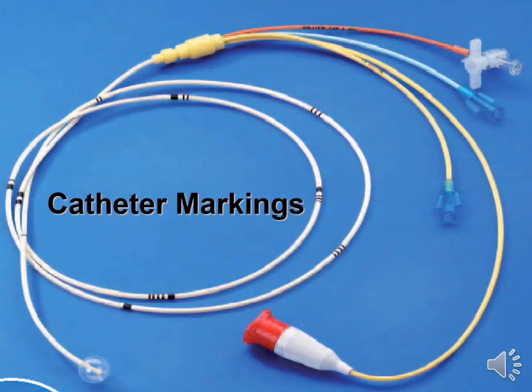There are markings on the catheter, and the catheter markings are typically narrow bands and wide bands. The narrow bands mean typically between these narrow bands it's 10 centimetres. So there you can see 3 narrow bands, 10 plus 10 plus 10 is 30 centimetres from the tip of the catheter.